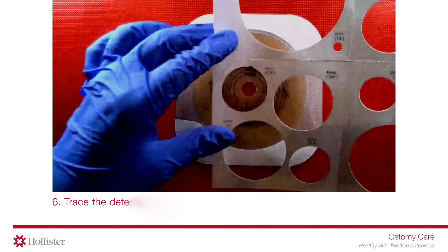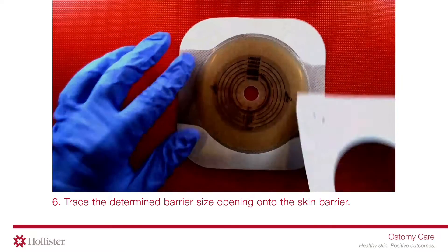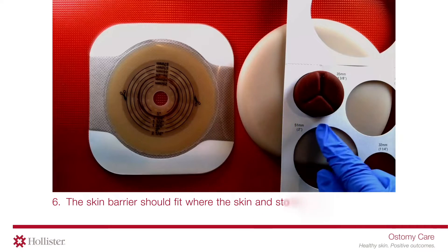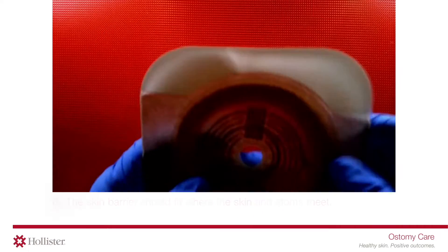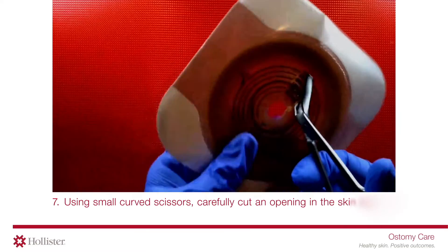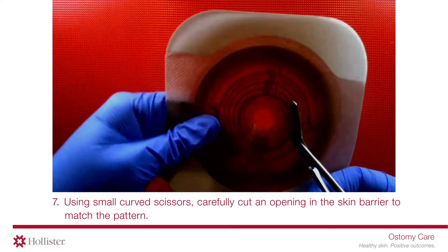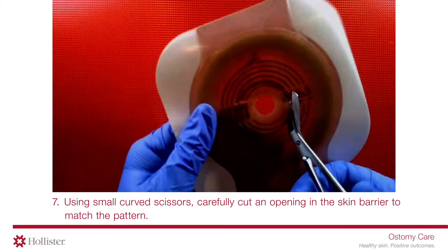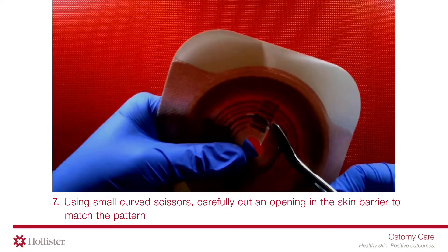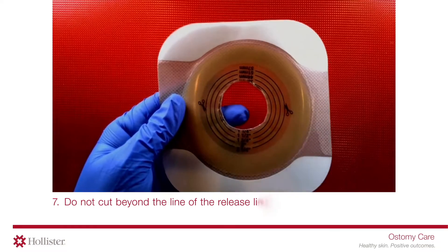Trace the determined barrier size opening onto the skin barrier. The skin barrier should fit where the skin and stoma meet. Using small, curved scissors, carefully cut an opening in the skin barrier to match the pattern. Do not cut beyond the line of the release liner.